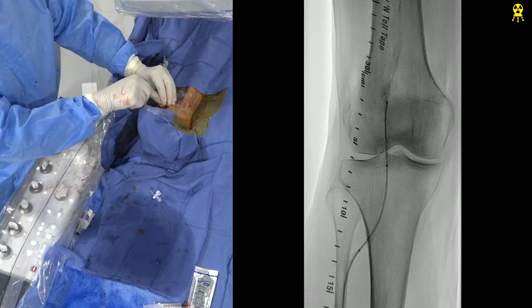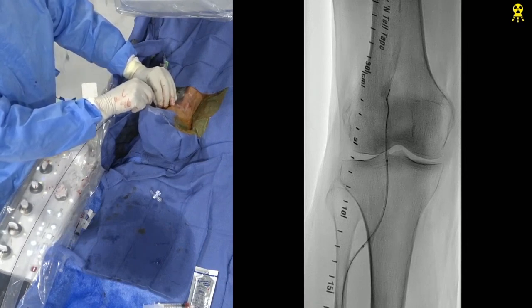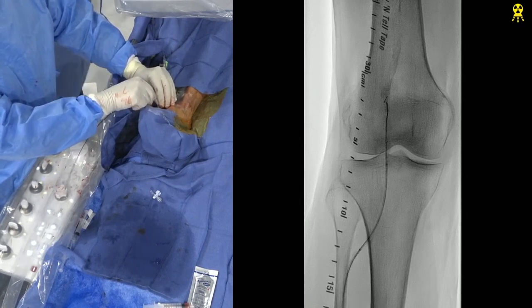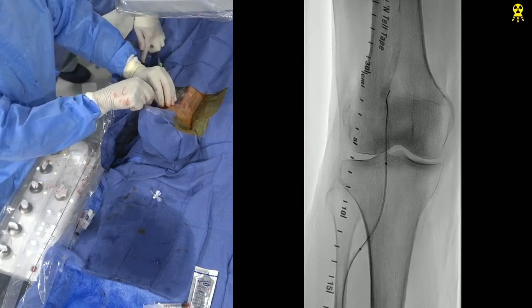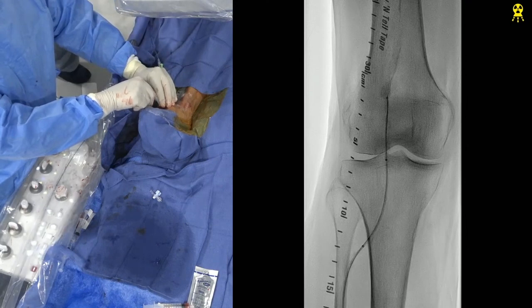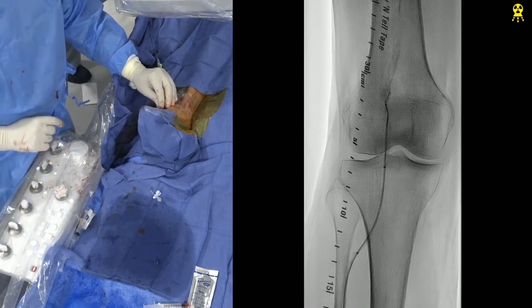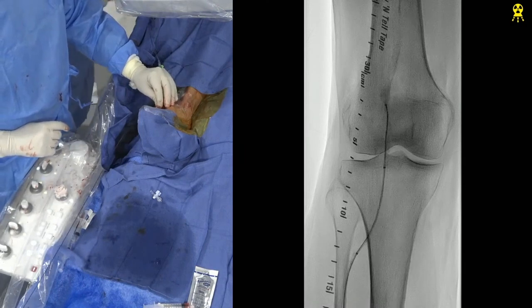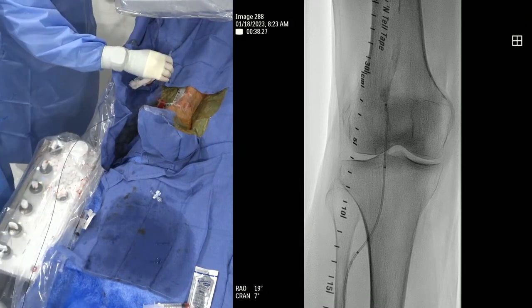So I think the other important thing is what you're treating. We're mainly treating claudication, right? Yeah. She has multi-level disease, which is kind of surprising. She's not worse off. But you could make the argument, if you're having trouble, to just treat one level. This is a little different because normally you treat proximal to distal. But another option is just to treat one segment if we can't treat everything.